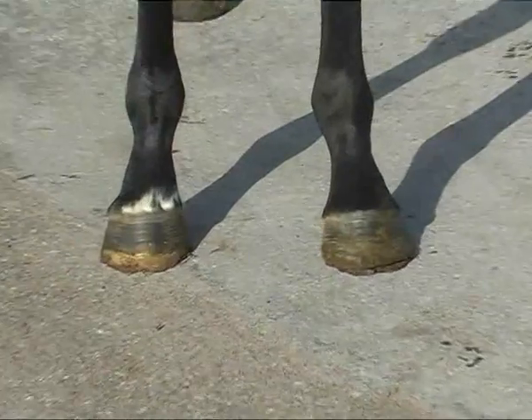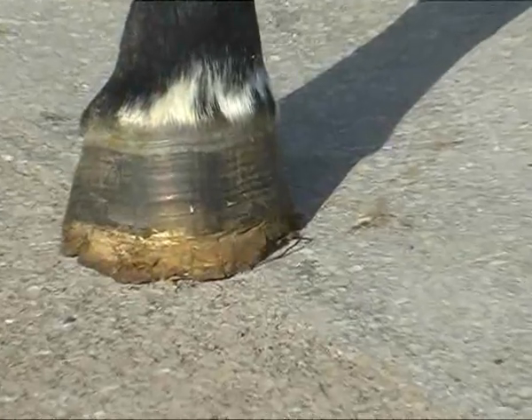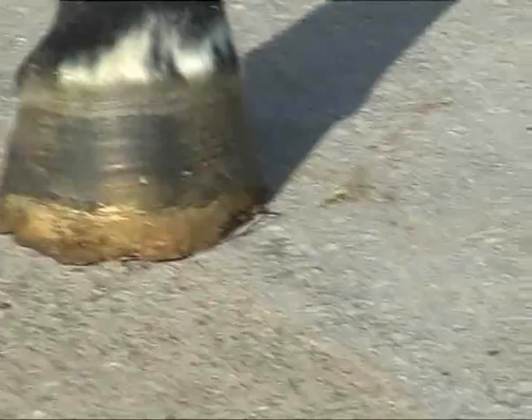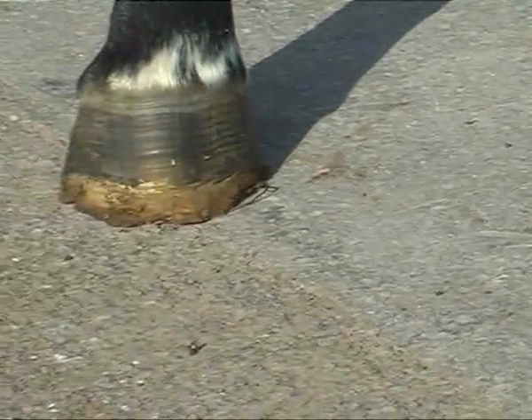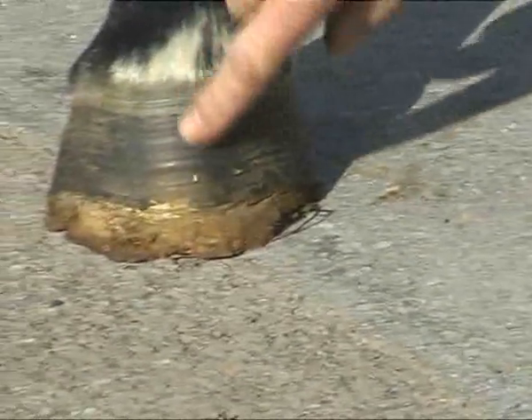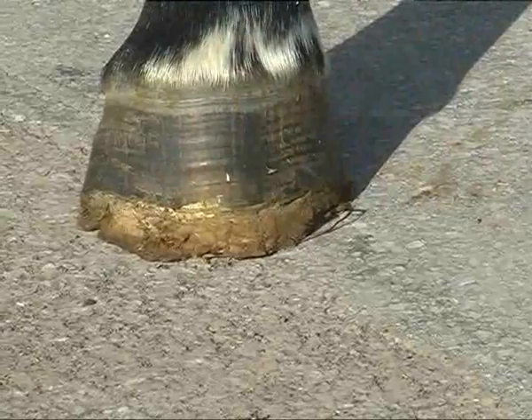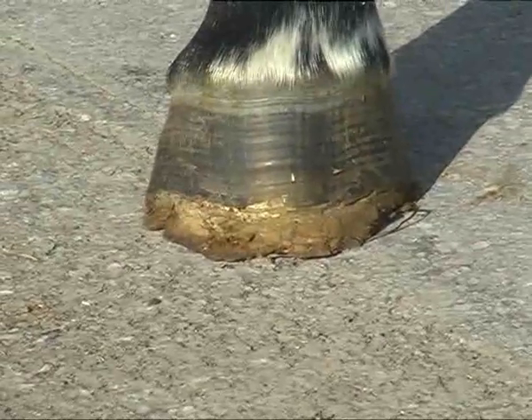This filly raced back in the last season on very hard ground and the hole in the front of the hoof capsule tore loose. She was turned out two months ago to give her a summer off because she's been in training for a year. You can see this area of horn here is fairly normal, but the area around the bottom that was detached — the white zone was detached and the whole lot has run forward.